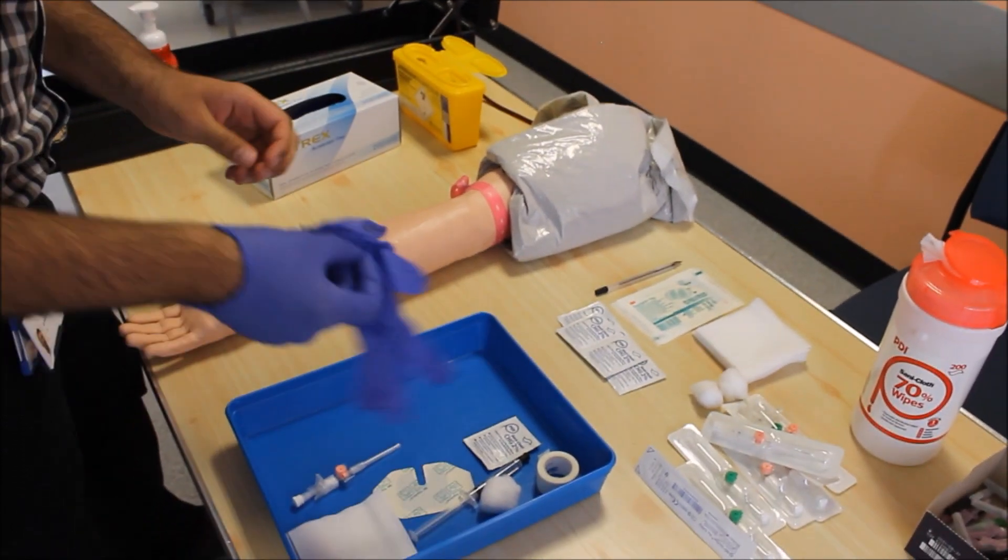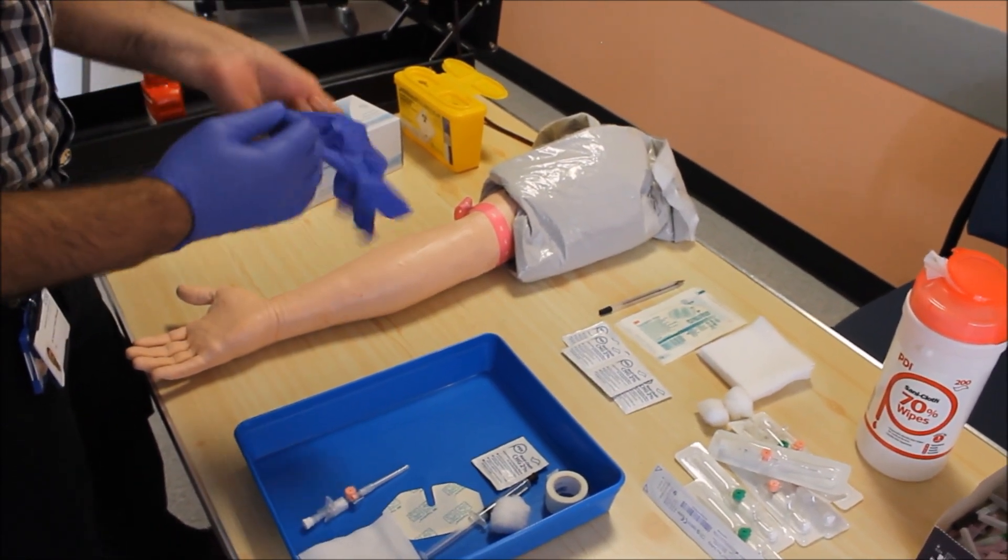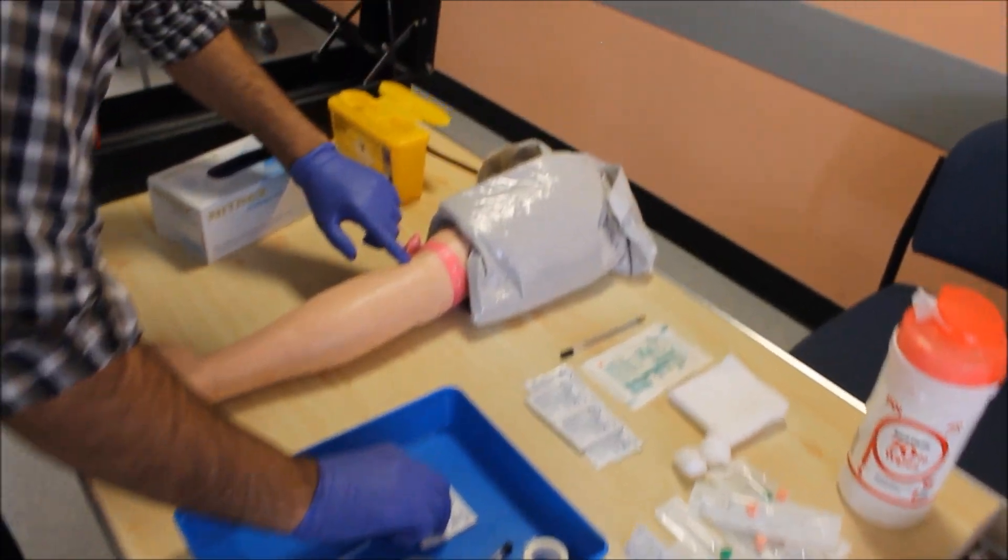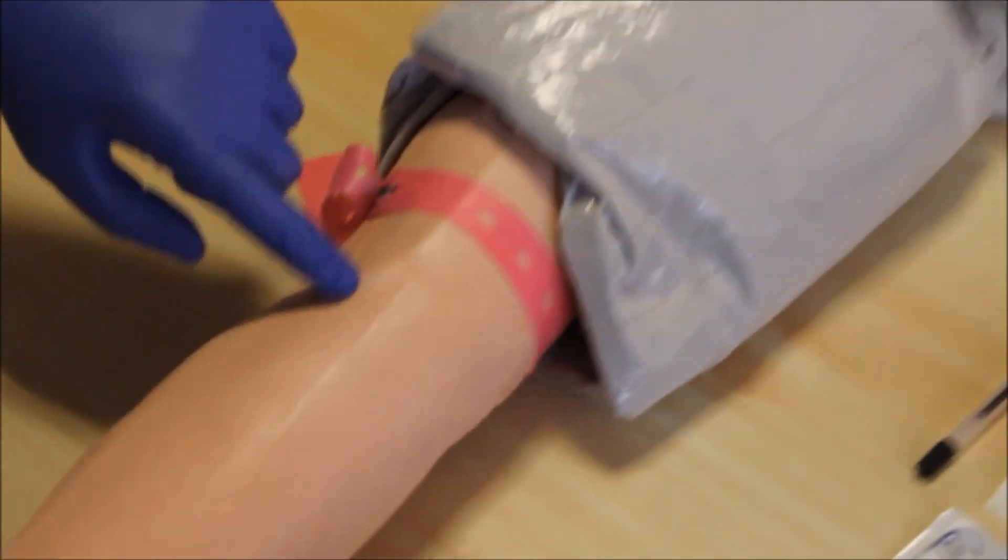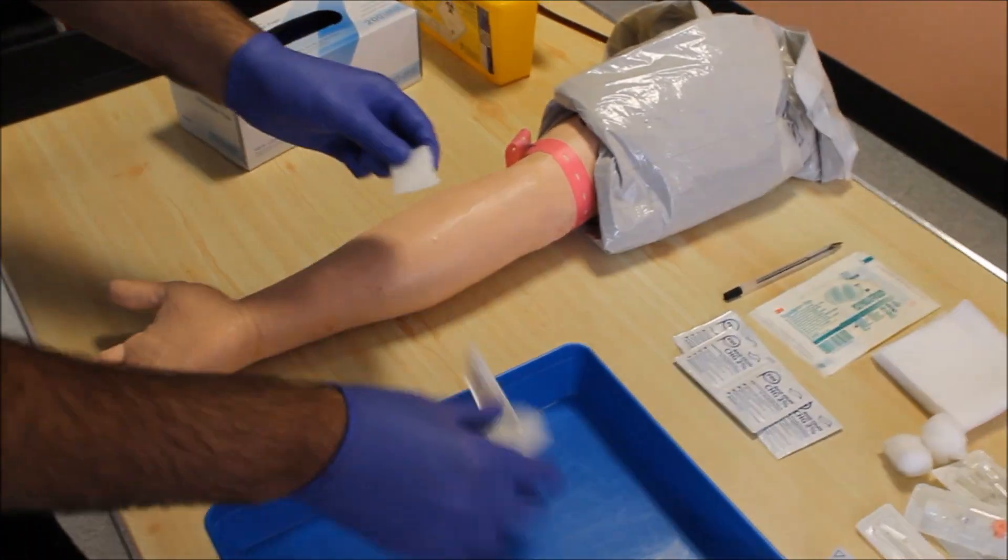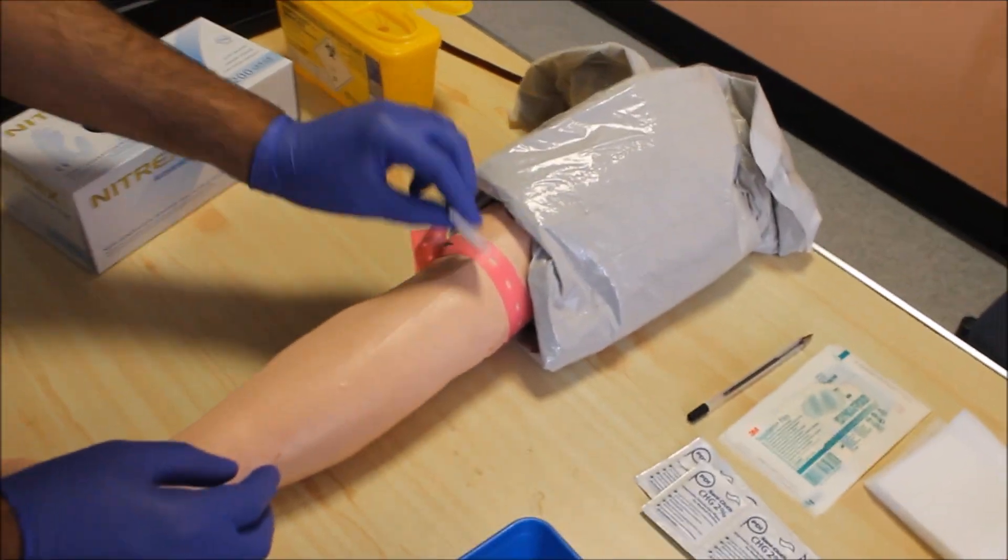Meanwhile, I'll quickly glove myself, then palpate the vein I saw before. Take the alcohol swab and give it a good clean.